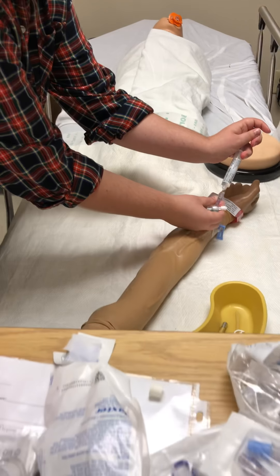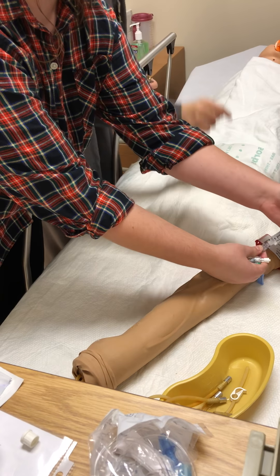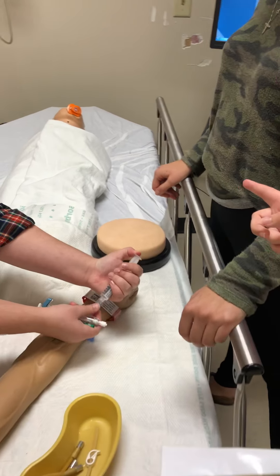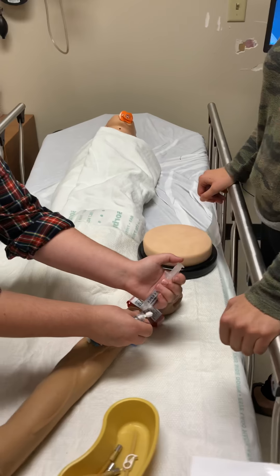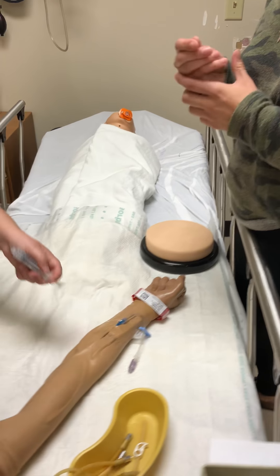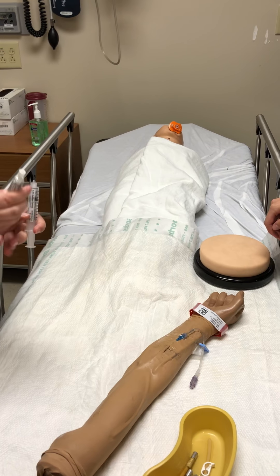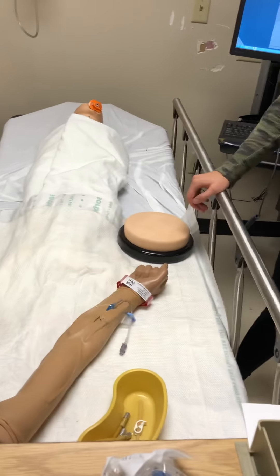Make sure after you push morphine, you push slowly because some of the morphine is still in the IV line loop. If you push it really fast, it's going to rush. Push it little by little. And it's more important for the flush after — to do it for 30 seconds. You can just push the med in, but it's the flush that you would time. I would still do it because morphine — if it's like four to five minutes — I will give it four to five minutes, and then the flush for four to five minutes.